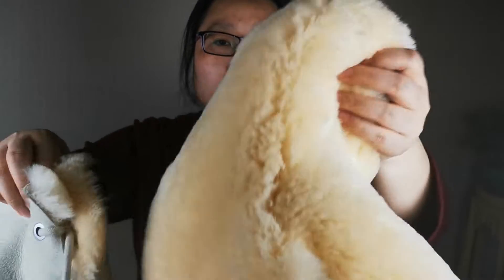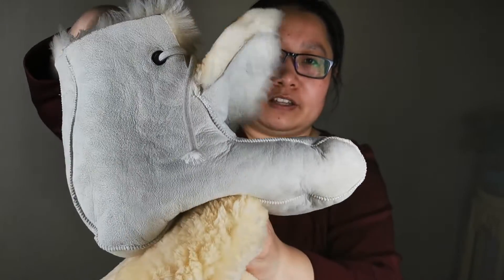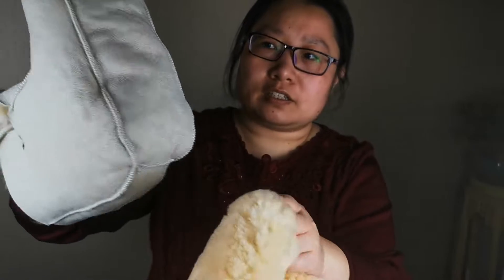You can see the inner part like that. A patient can use it to keep their feet warm and comfortable. Size can be customized.